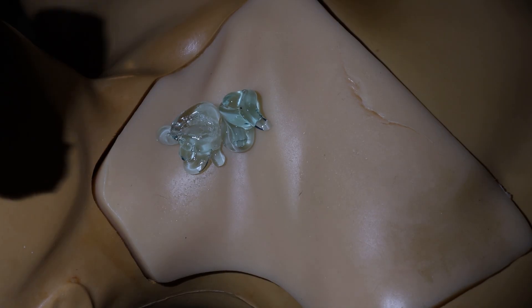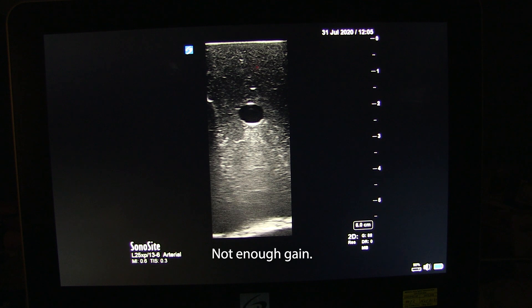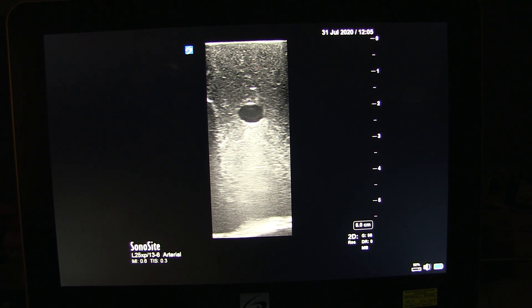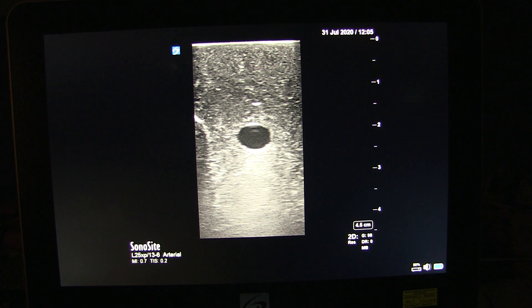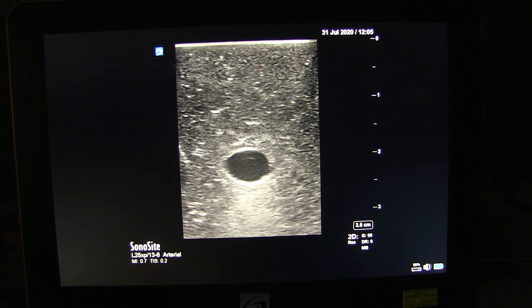When you get the ultrasound probe down onto the skin, you'll want to adjust the gain and the depth. The gain basically determines how bright the picture is. Too little gain and your eyes won't detect important details; too much gain and the natural noise in the signal will become too bright and obscure important details. Adjust the depth so the target vessel and overlying tissue take up most of the screen, and if there's an important deeper structure to keep track of, make sure it stays in the window as well.